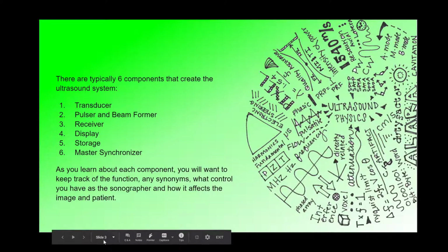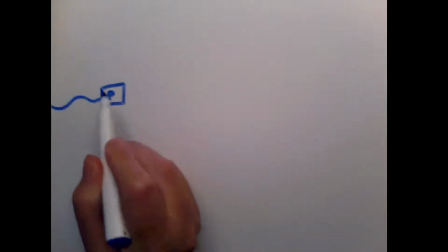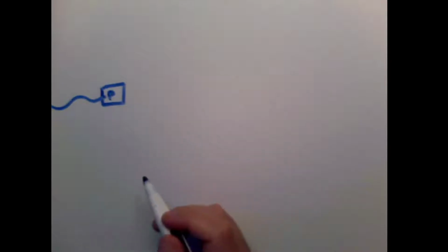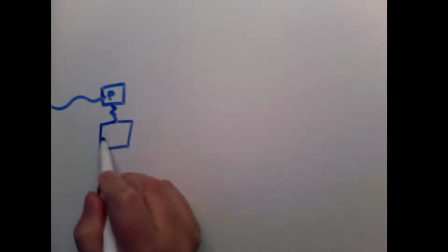And so I don't have a picture of this in your notes. I should draw something and post it. But we talked about those 6 components, and I talked about, we're not going to open up a machine and take a look at each one, but basically what happens is we have the pulsar, and the pulsar is going to be getting the energy from the outlet, right? So the plug's coming in and into the pulsar. So the pulsar is ultimately responsible for the voltages that come out of the machine. So it creates a voltage, and that's going to go down to our beamformer.